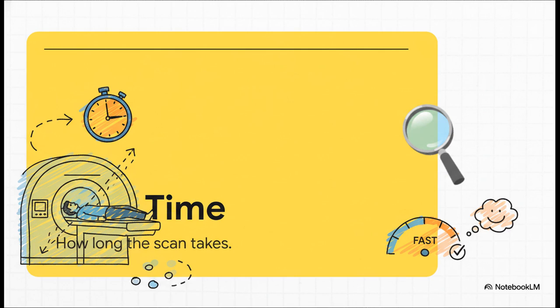And last but not least, we have the one that's super straightforward but often the biggest headache, scan time. It's exactly what it sounds like. How long does the patient have to lie perfectly still in that scanner? And you always want this to be as short as humanly possible, for patient comfort and to keep them from moving and blurring the picture.